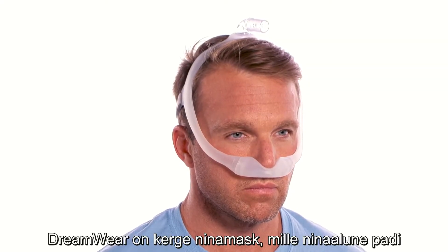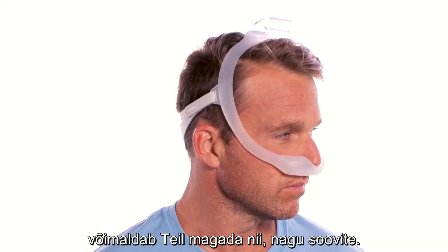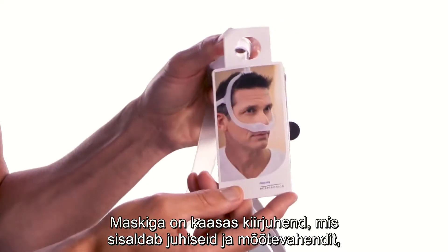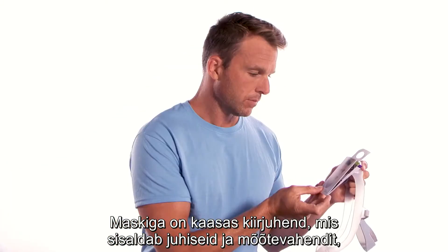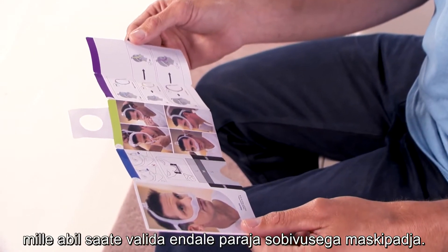Dreamwear is a lightweight nasal mask with an under-the-nose cushion that offers the freedom to sleep how you want. Your mask comes with a quick start guide which contains instructions and a sizing gauge to help you get a good comfortable fit.